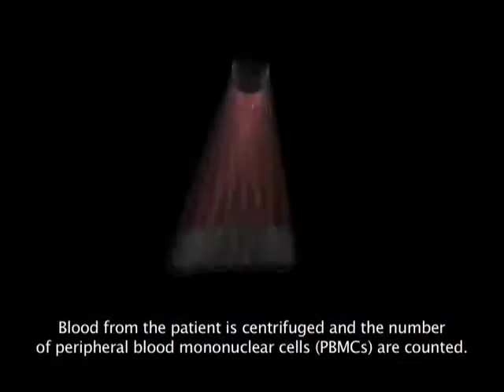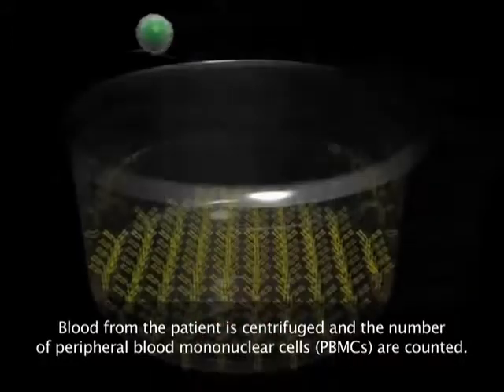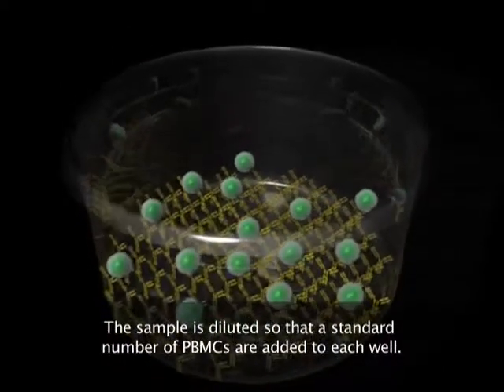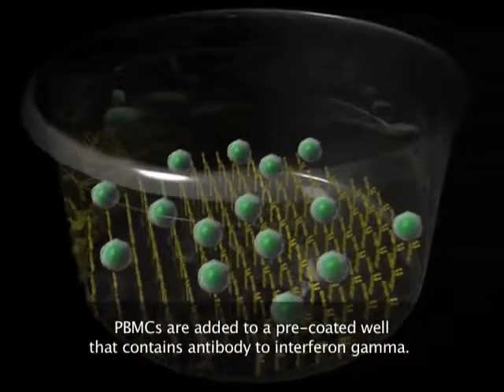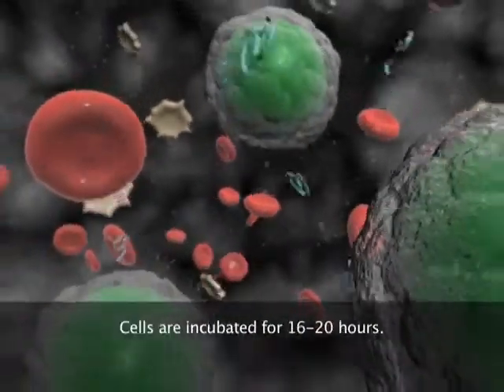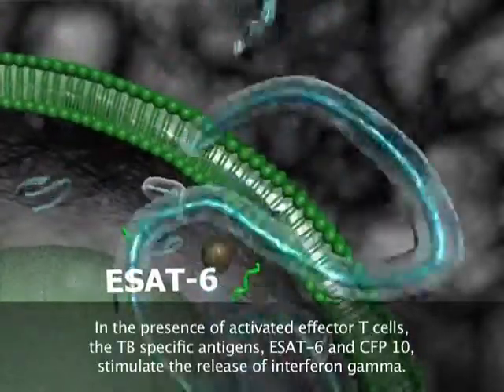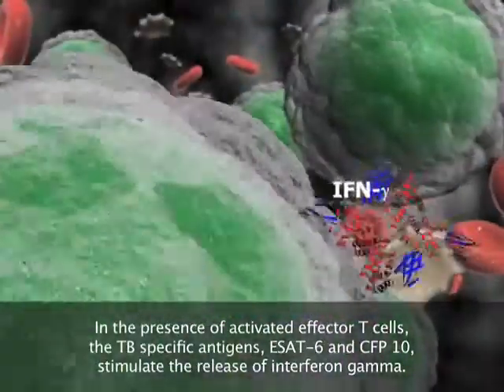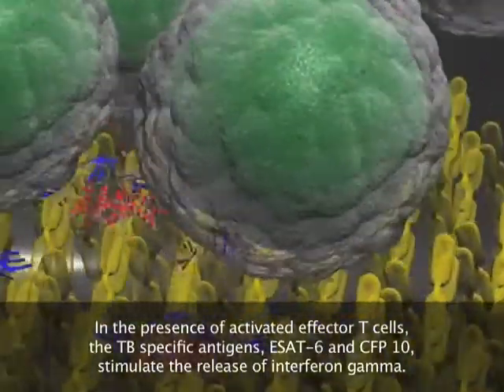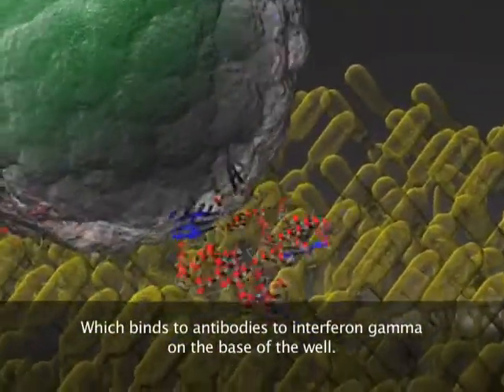Blood from the patient is centrifuged, and the number of peripheral blood mononuclear cells, PBMCs, are counted. The sample is diluted so that a standard number of PBMCs are added to each well. PBMCs are added to a pre-coated well that contains antibody to interferon gamma. Cells are incubated for 16 to 20 hours. In the presence of activated effector T cells, the TB-specific antigens eSAT6 and CFP10 stimulate the release of interferon gamma, which binds to antibodies to interferon gamma on the base of the well.